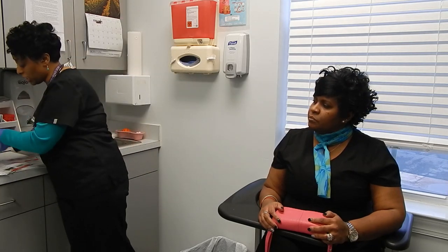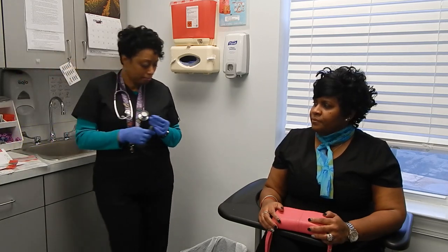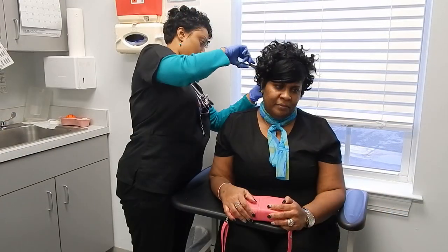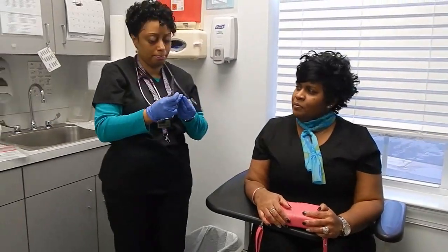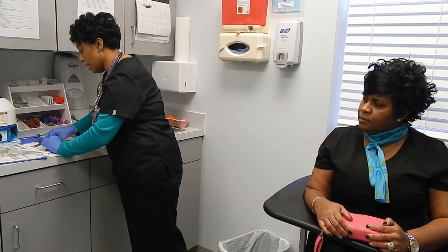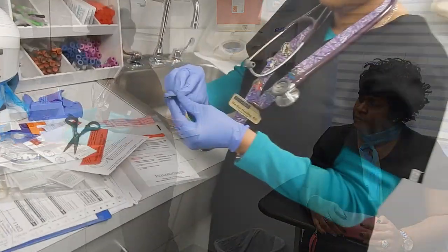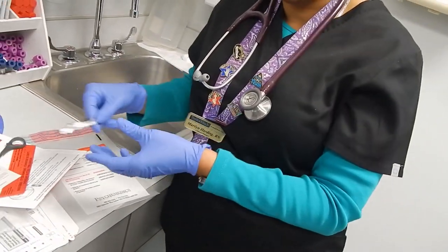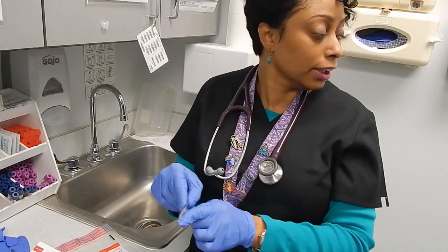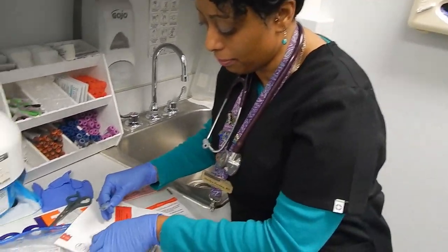Have you had your hair collection done before? No. Let me get you to turn to the side. So what I'm doing now, I'm aligning where the root of the hair begins with the direction of this foil container that they provided within the hair collection kit. When it gets to the lab, they'll know that this is the direction of where the hair was cut, where the closest hair was cut from the scalp.